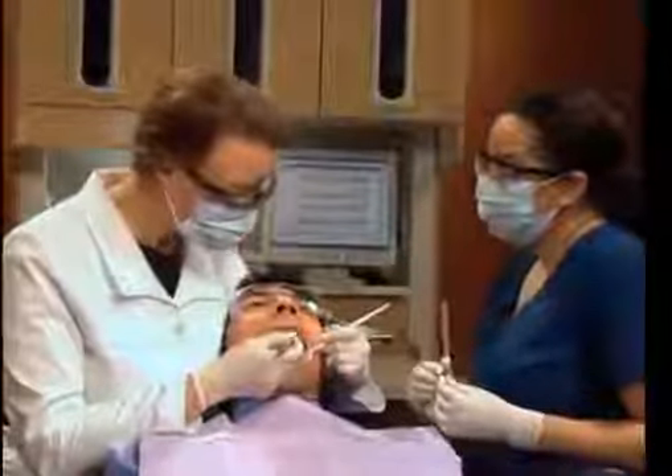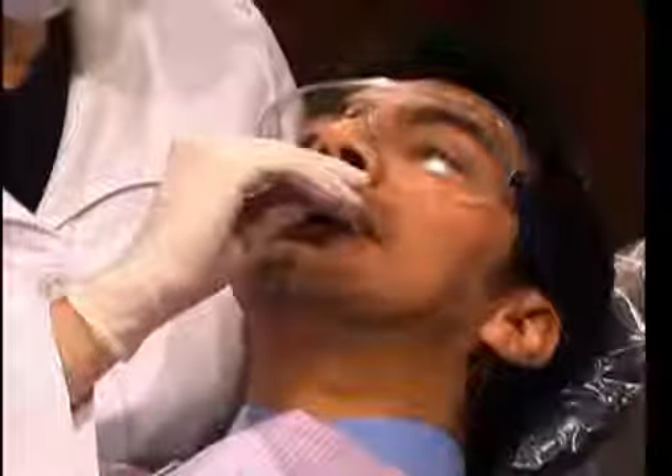When it's ready, we'll place the denture onto the implants, check the fit and your bite, and you'll have your beautiful new denture.